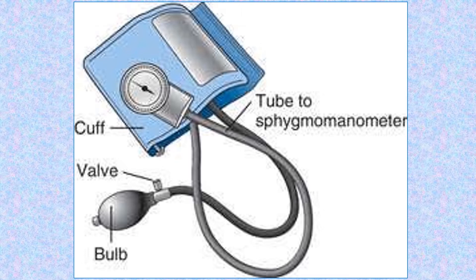Keep inflating until you feel no sound and no pulse. Then begin deflation at two millimeters of mercury per second — slowly, gradually deflating. Continue until you hear the first sound. That sound is the first Korotkoff sound, and this represents the systolic blood pressure reading. Continue deflating until the sounds completely disappear — that is the diastolic blood pressure.